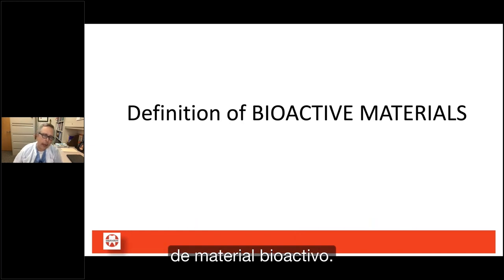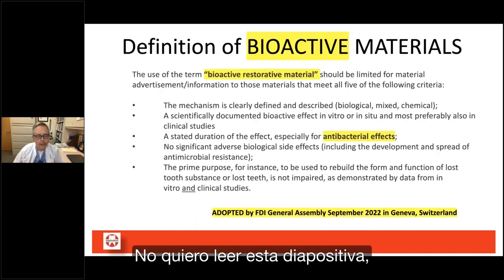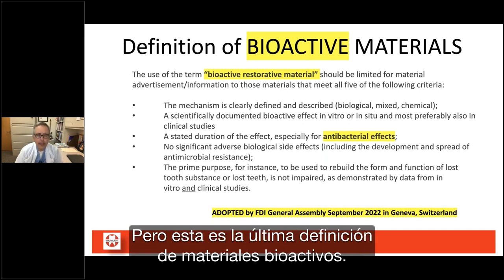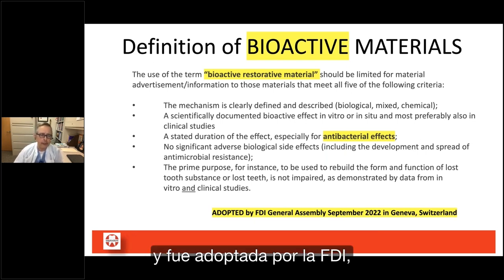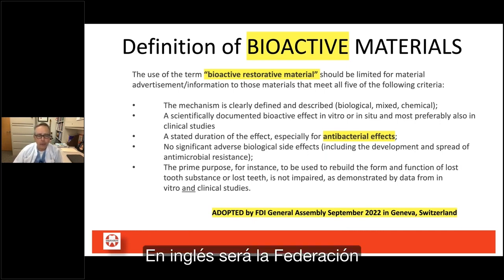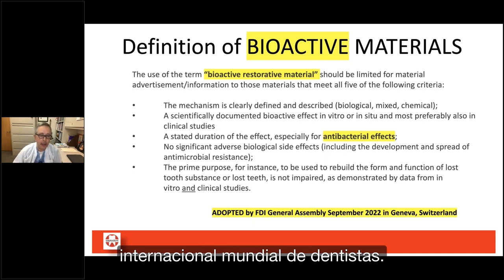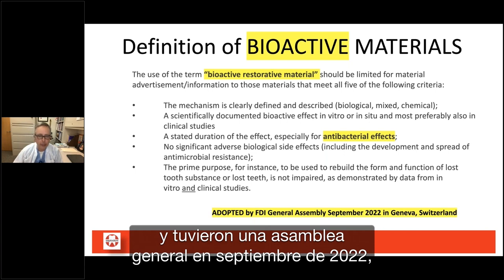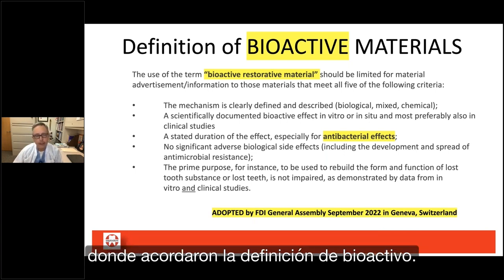Let's start with the definition of a bioactive material. I don't want to read this slide; you can probably read it better than me, but this is the latest definition of bioactive materials, and it was adopted by the FDI. This is, I believe in French, Fédération Dentaire Internationale. In English it is the International Federation of Dentistry, which is really the World Association of Dentists. This organization is based in Geneva, and they had the General Assembly in September of 2022, and they came up with the definition of what is a bioactive.